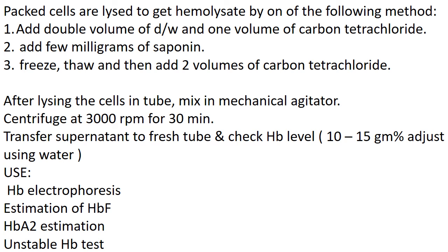Uses of this hemolysate. The hemolysate can be kept for some weeks, and it is used for hemoglobin electrophoresis, fetal hemoglobin estimation, hemoglobin A2 estimation, that is adult 2 hemoglobin estimation, and unstable hemoglobin tests.